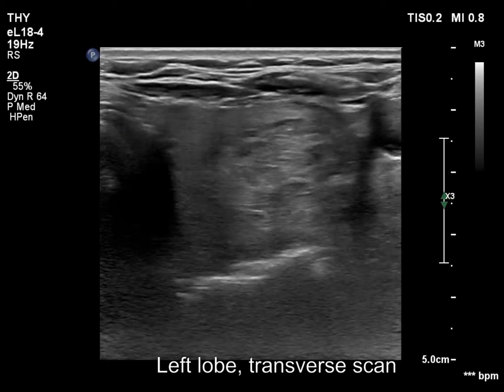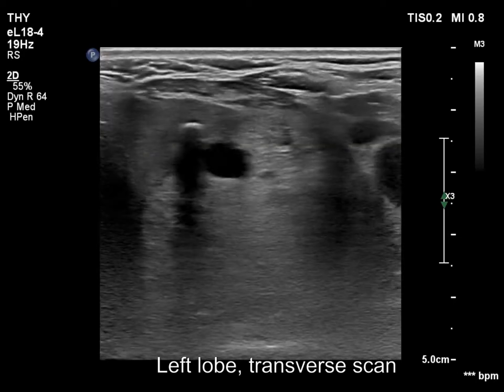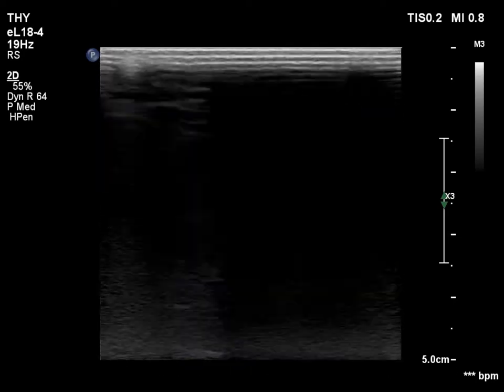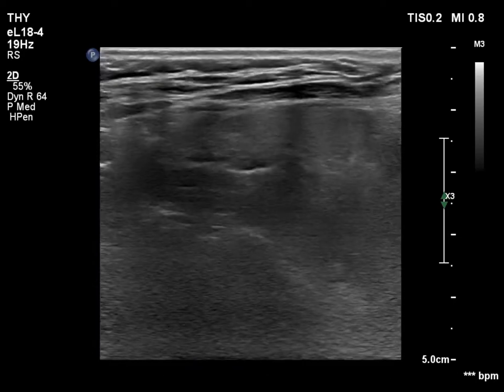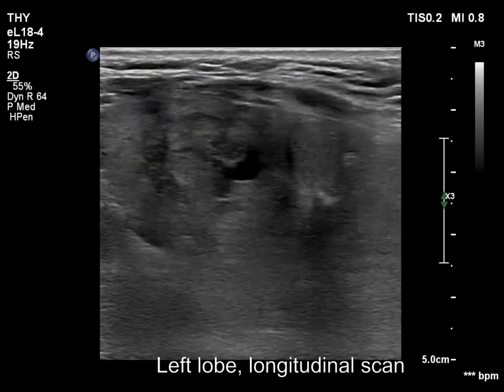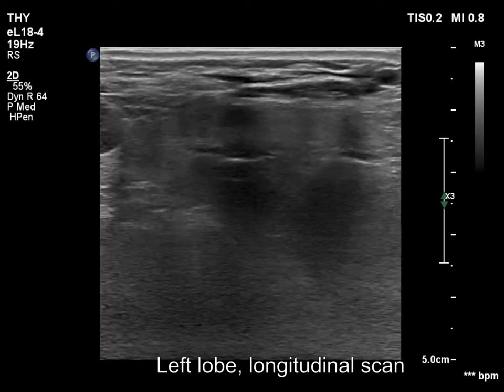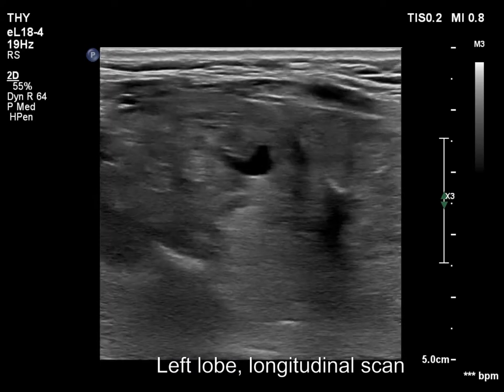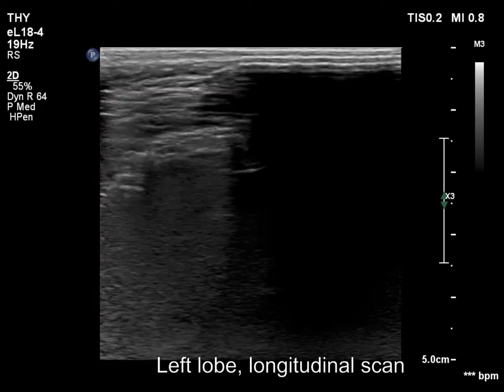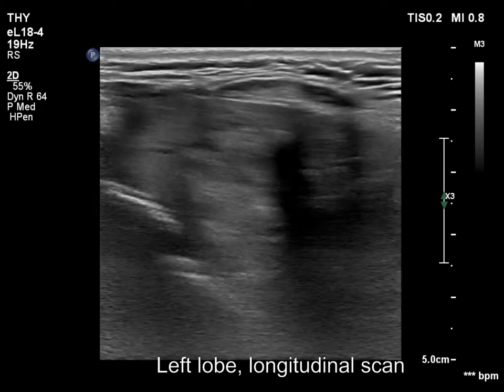First, we analyze the left lobe with better harmonization. An isoechoic nodule occupies a great proportion of the ventral half.